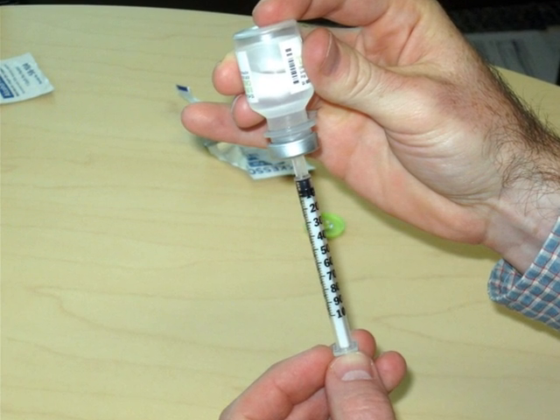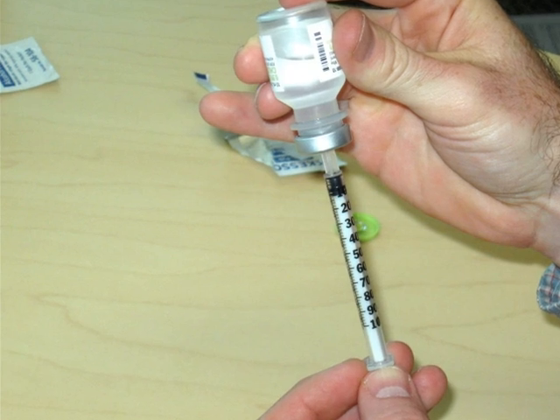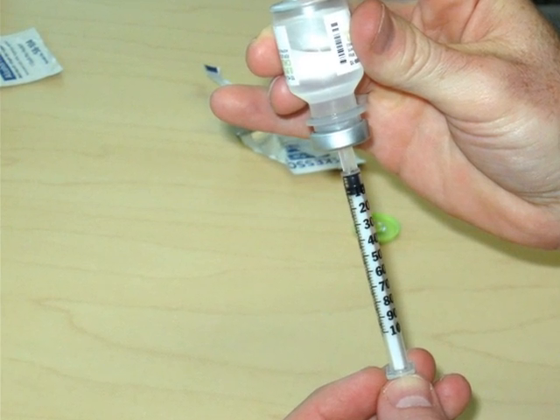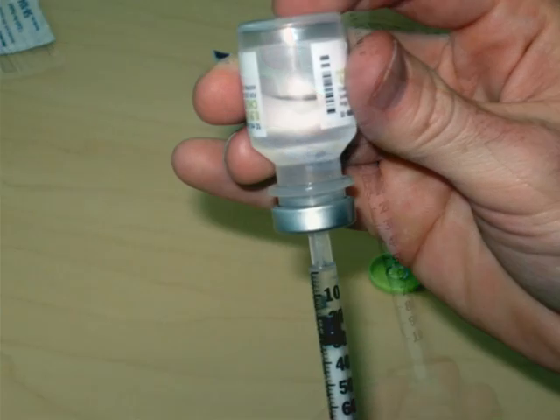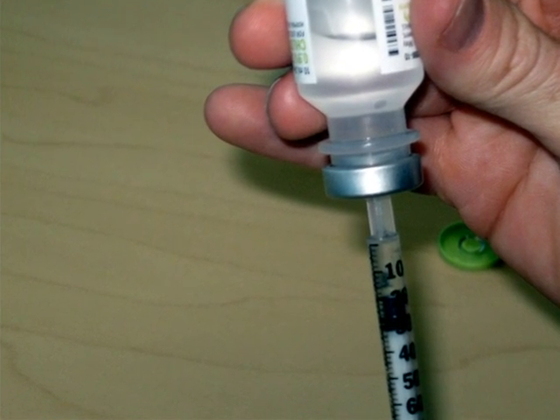Keep the syringe in the bottle and turn both upside down, making sure the tip of the needle is well within the insulin in the vial. Then, pull the plunger back until you have the correct dose of insulin.